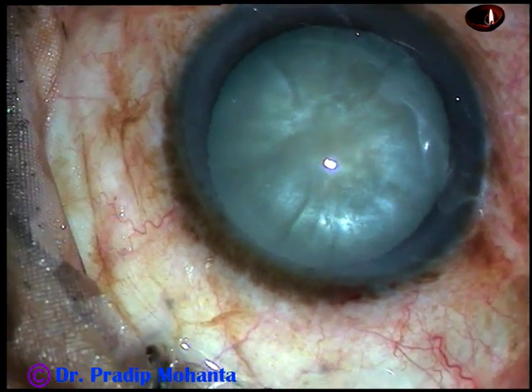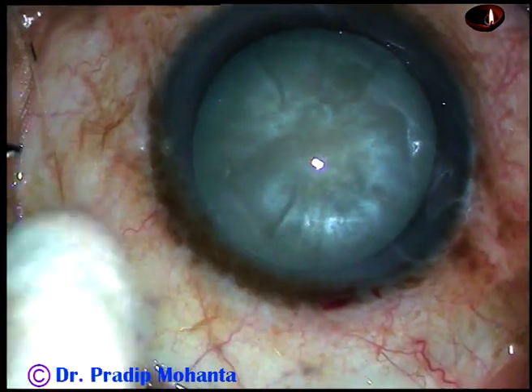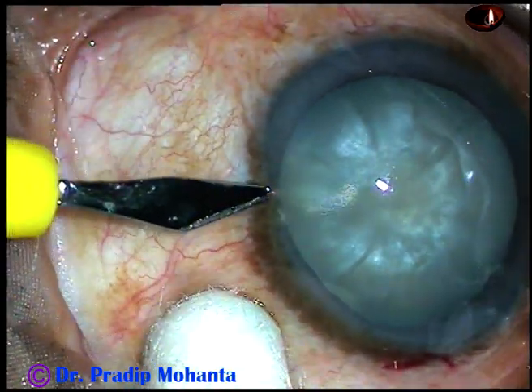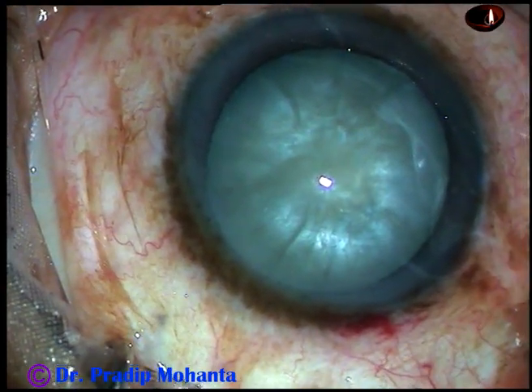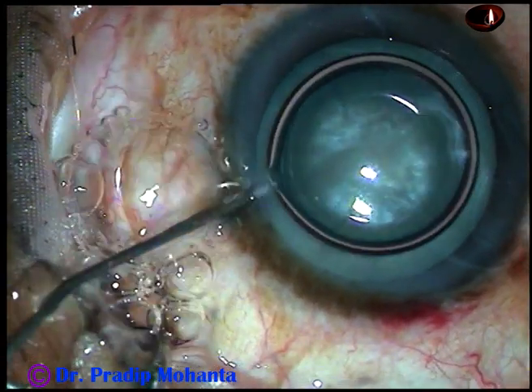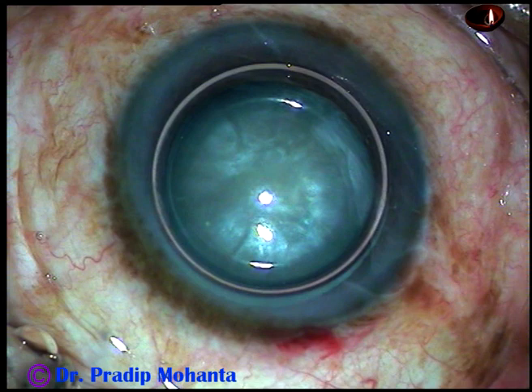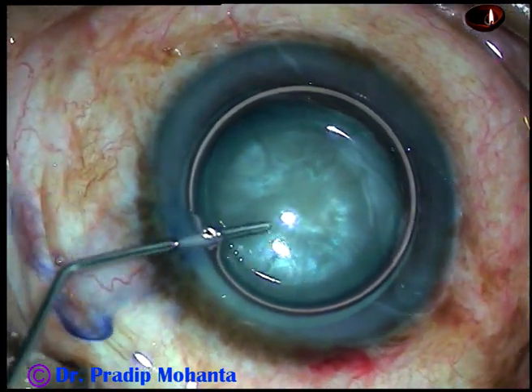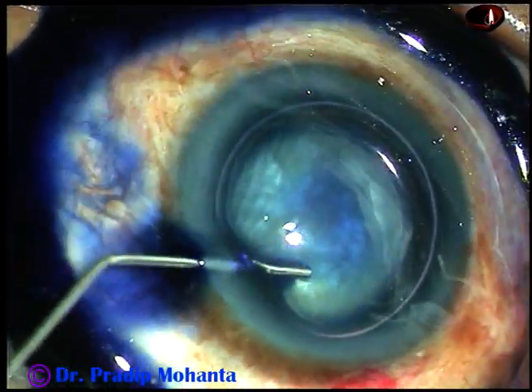And now, one paracentesis is being made on the left side of the main incision, about 3 o'clock hours away. And now, an air bubble is being injected into the anterior chamber. And underneath this air bubble, trypan blue dye is applied over all parts of the anterior capsule.